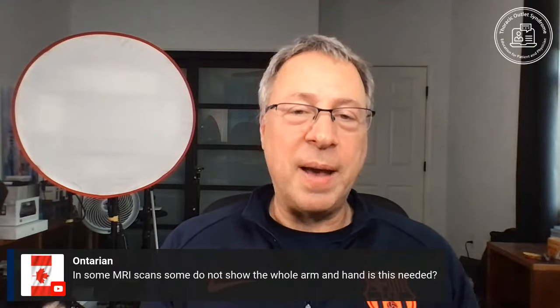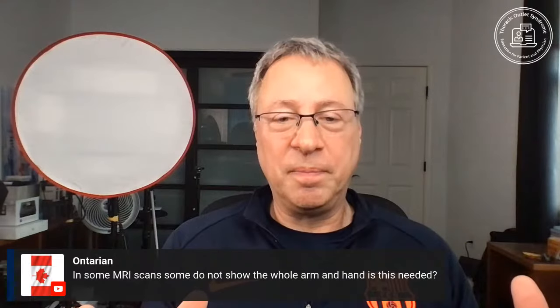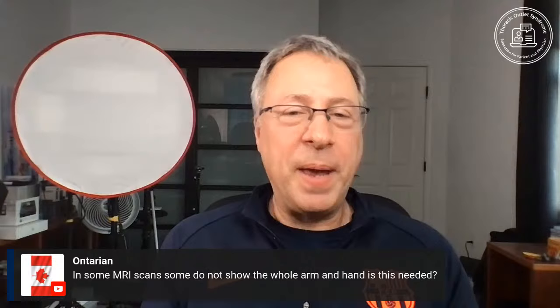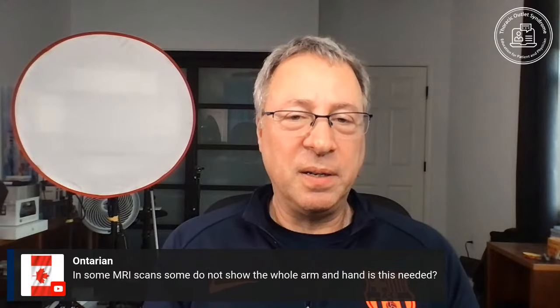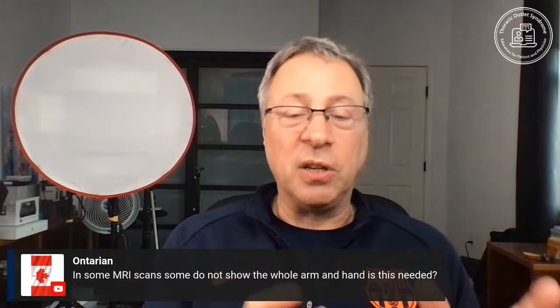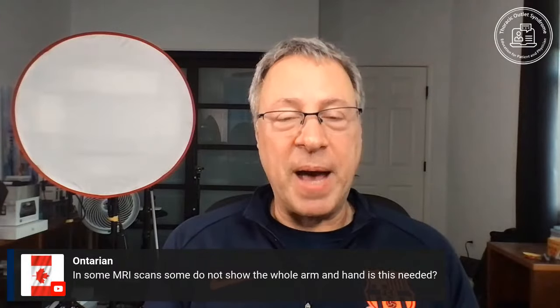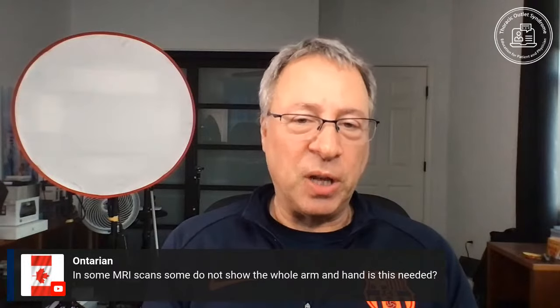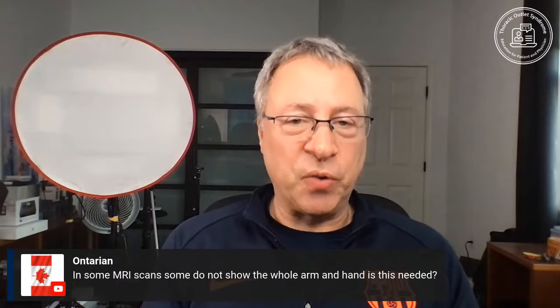So if we use an MRI with a large field of view, meaning that we take an image of an entire arm, we won't be able to see the fine detail that we need. If the patient has a large mass and we want to see the edges of the mass, we might do that. But in the thoracic outlet, where I specialize, we want to see some pretty small structures.